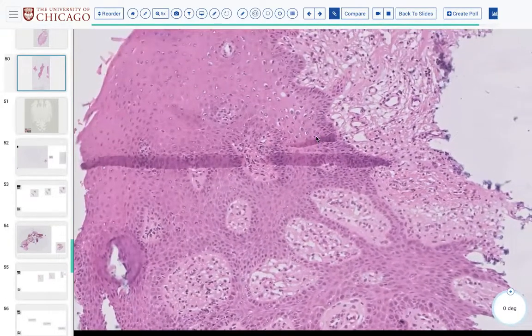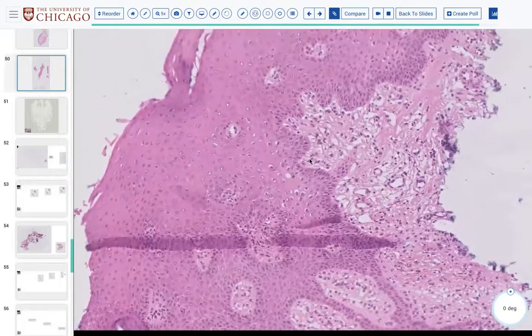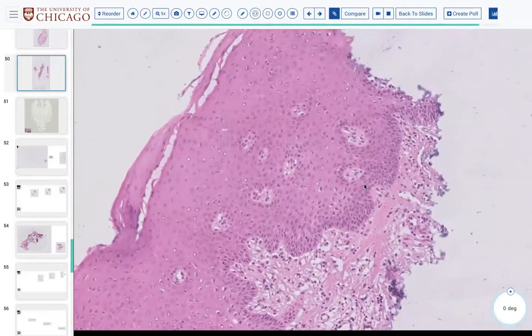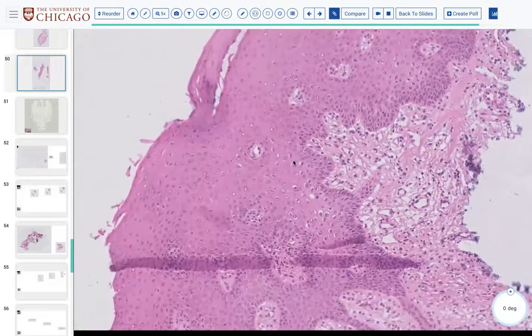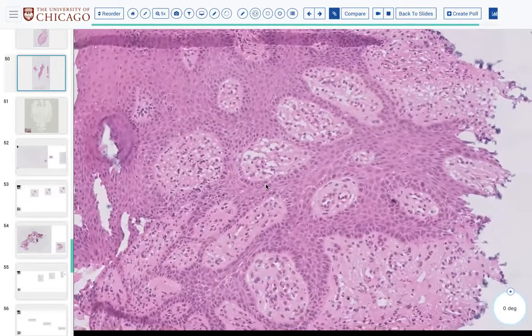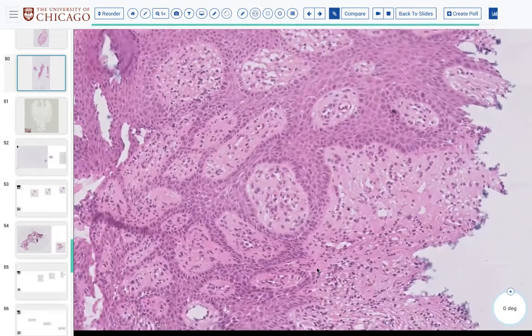But is the disorientation because of the embedding? Sometimes it's embedding, but sometimes it's just the way that the tissue is sent to us, where we embed it pretty much as we receive it, and it's just a matter of how it's cut out of the patient.